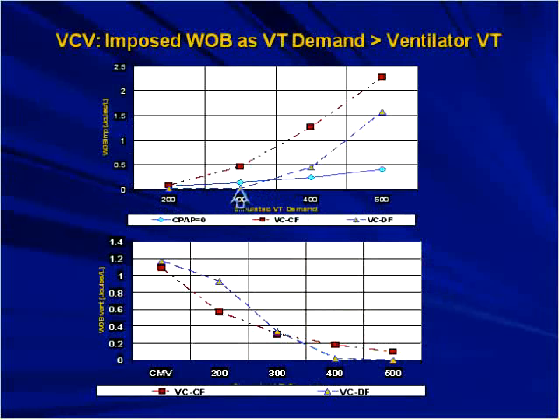And the blue line was CPAP, just the intrinsic load on the lung model, or the simulated patient load, to get that size breath and the flow rate generated with it. And you can see that the work of breathing goes up slightly as the patient pulled in the breath.